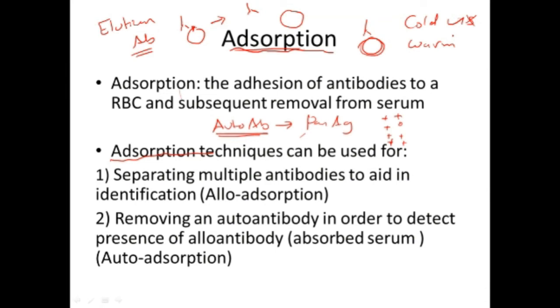الإنزيم تكنيك excellent. Selected cells excellent. Okay, وقلنا selected cells بيكون عندي looking excellent لطيف also. We have a red blood cell carry one antigen and lacking the other antigen that I expect the patient have a low antibody against. So by using this way, we will be able to ruling in or identify or ruling out other antibodies.